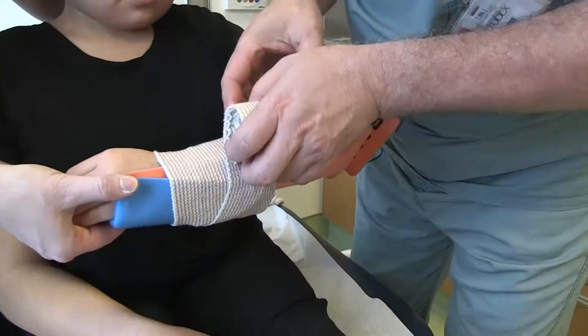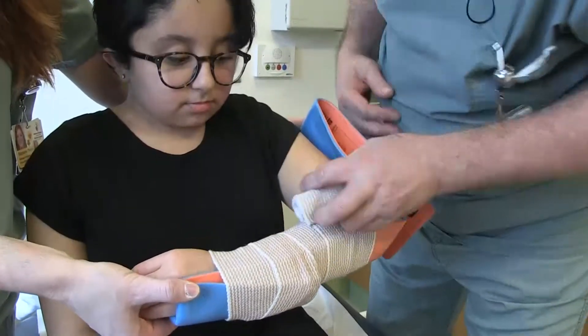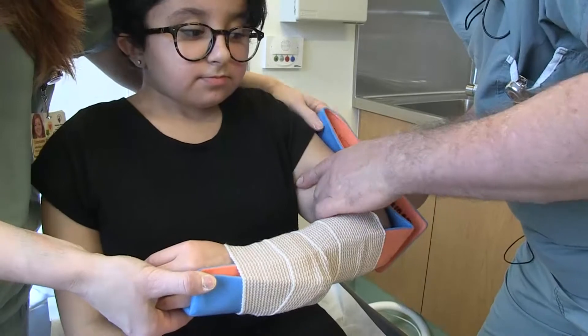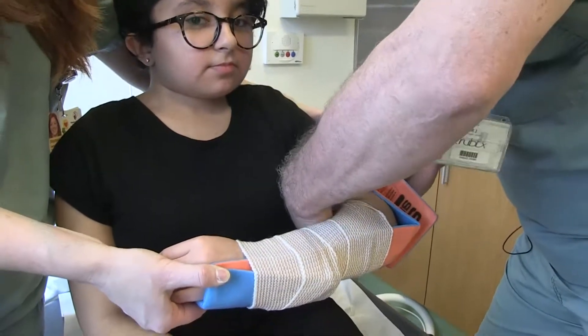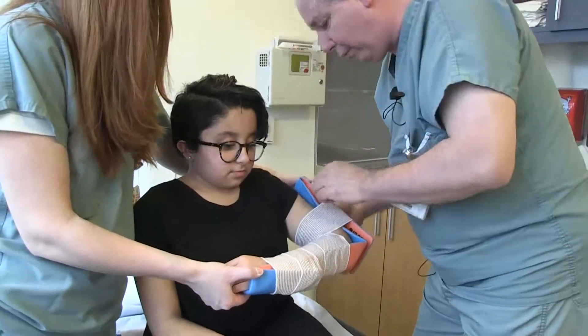Is it comfortable? Do you feel it's stiffer than the other cast you previously had? Yes, it is stiffer. So comfort-wise, obviously a real plaster with cotton wool or a fiberglass brace would be more comfortable than this one.